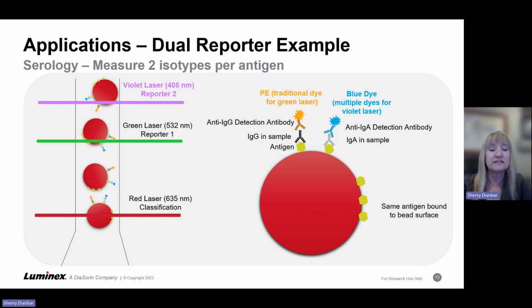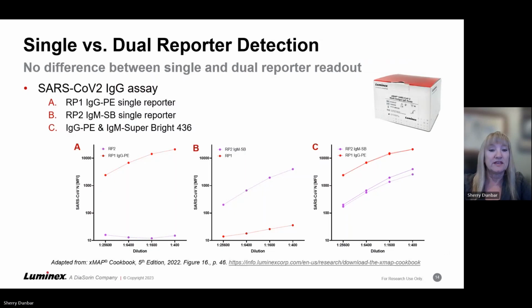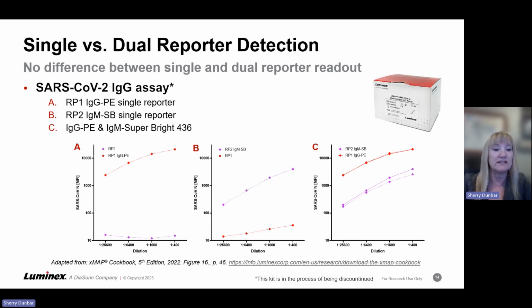So now let's look at some real data using an assay similar to this one described in this cartoon. So here we used our xMAP SARS-CoV-2 multi-antigen IgG assay kit, but we swapped out some different detection antibodies to look at different isotypes in different reporters. So what we have here is 3 panels, identical reactions, all run in dual reporter mode on the instrument, but we either had just one of the detection antibodies or the other detection antibody or both together in the same reaction. So on the left, panel A, you can see that when we have an IgG PE labeled detection antibody, we're seeing a dose response to the IgG signal in the red line. And the signal in the second reporter channel is negligible.